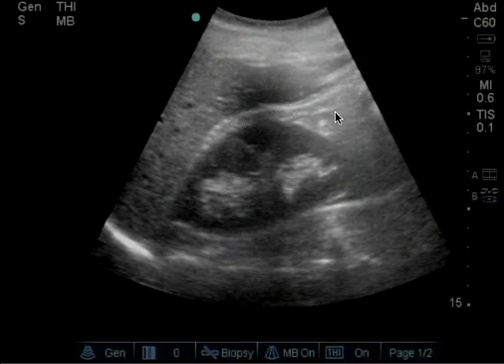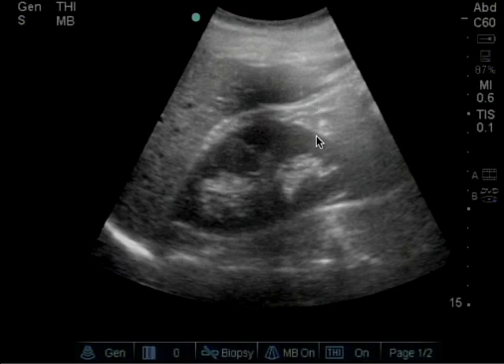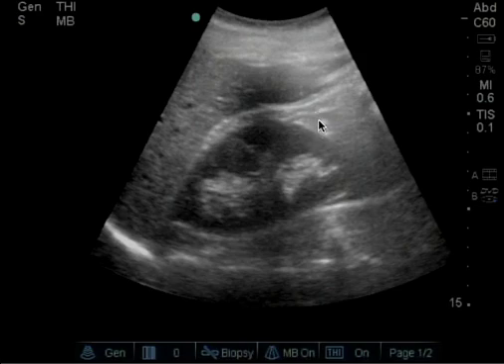The presence of these two hyperechoic lines forms a double line, which is known as the FAST double line sign, or double line sign for short. The hypoechoic internal echo structure contained between these two lines is perinephric fat.